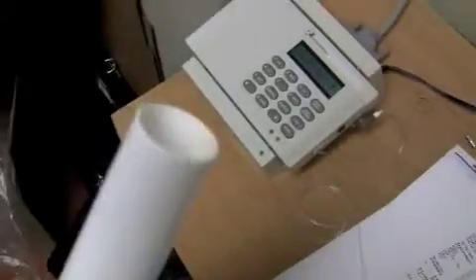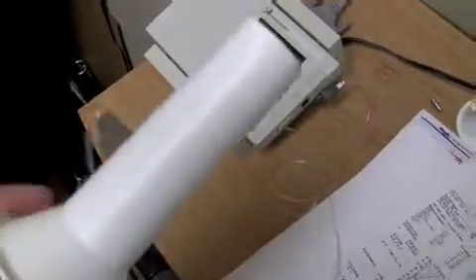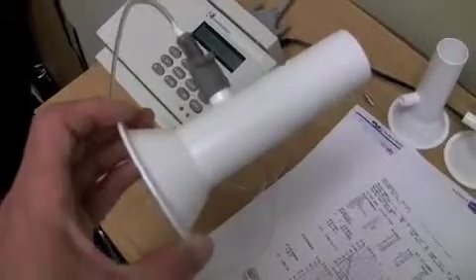Okay, grasshoppers, go forward and do your task. Patient will put it in their mouth. Let them take it out of a sealed wrapper so they know it's new.